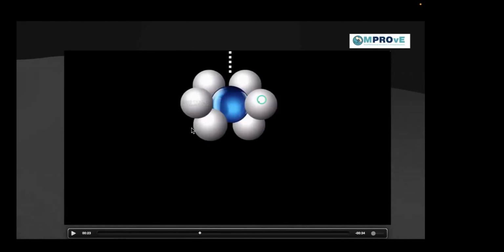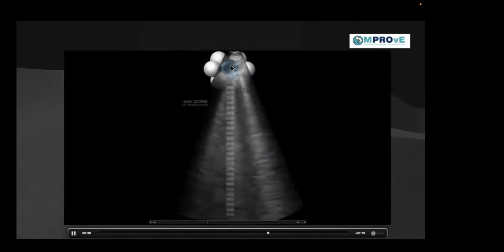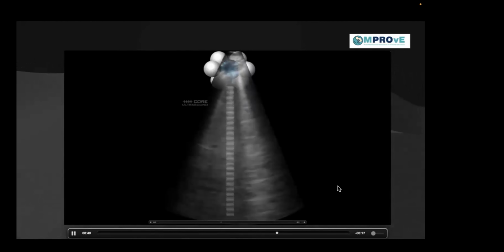So these are different alveoli, and there's a septum in between, and there is your fluid. So whenever you do a scan and your ultrasonic sound comes through it, as I said, it loves the fluid, so it has no problem coming all the way in. But then these alveoli are filled with air, so it reflects back and forth.